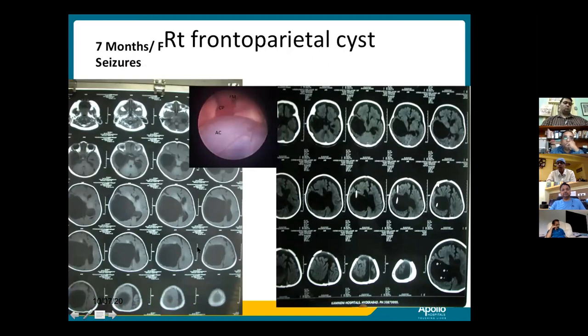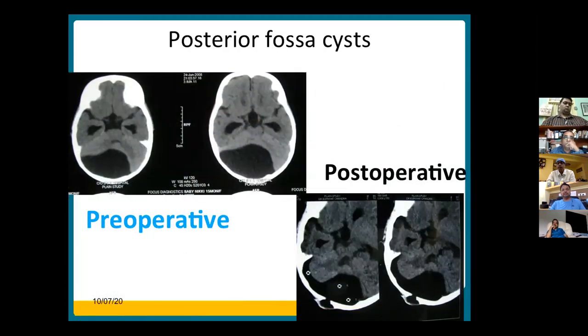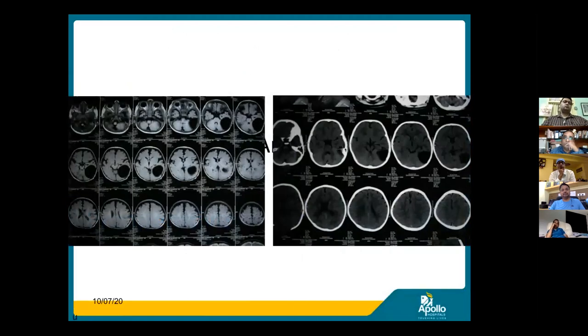There are different locations of the large arachnoid cyst actually. You can see here, projecting into the ventricle, the choroid plexus, the foramen of Monro. So cystoventriculostomy is sufficient in many of these cases. These are the posterior fossa arachnoid cysts. Slightly gray, difficult areas when they're away from the ventricle. You have to put a shunt or you do a marsupialization, because again the fear is of CSF leak and pseudomeningocele. There's again a CP angle large arachnoid cyst communicating into the cisterns.